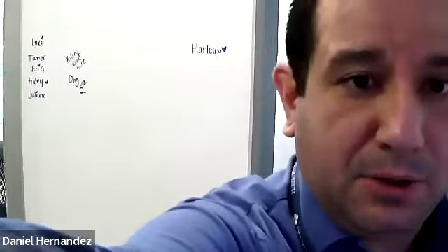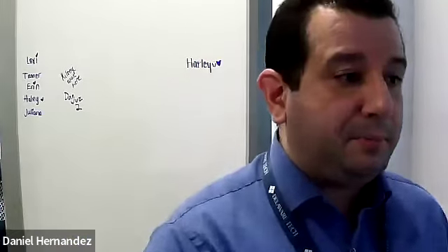It's important to look for free fluid because we also worry about the potential that this appendix is already ruptured. So if you're scanning, looking for the appendix and you see a larger fluid collection that particularly has loculations or septations within it, so it's not simple free fluid, that's concerning for the potential that this appendix is ruptured already and we are developing abscess formation now. So any sort of complex fluid is not a good sign.